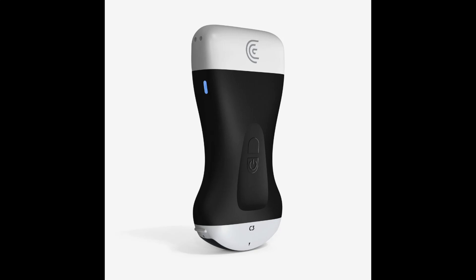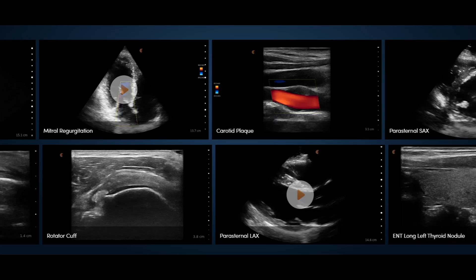The Clarius HD3 comes next, and it's the AI-powered marvel. This one offers high-definition images with AI assistants. It's for those who need the best — the high-tech one that could probably also do your taxes if it felt like it. It's for those needing detailed scans, so if you're a professional who likes to geek out with tech, this might be your best friend. It's like having a super smart assistant, always one step ahead, always knowing what you're trying to see.